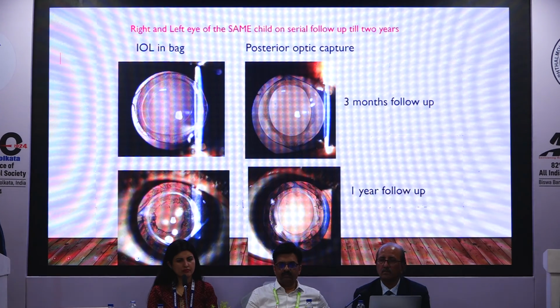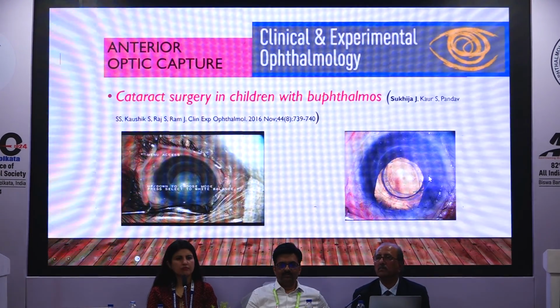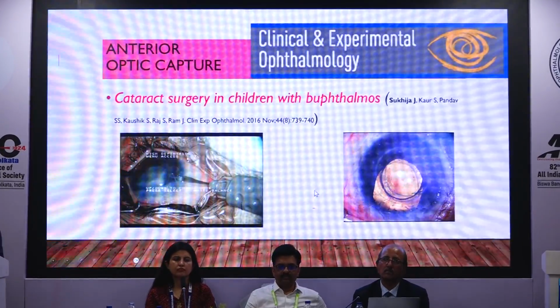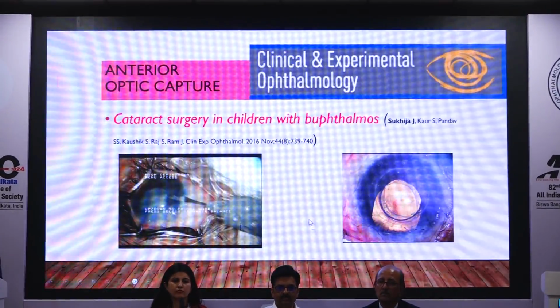And in the other eye, we did the capture. You can see everything is in the bag. These epithelial cells are in the bag. Nothing is coming to the center. So it does help. But obviously in our study we found that the incidence of PCO was the same. I mean, we did not find any visual axis opacification. So whatever you're comfortable with, you can do.